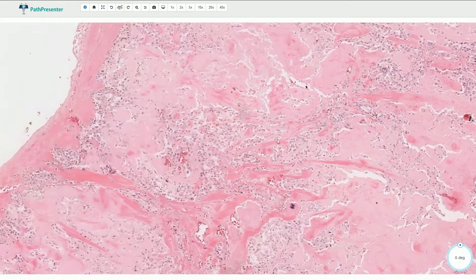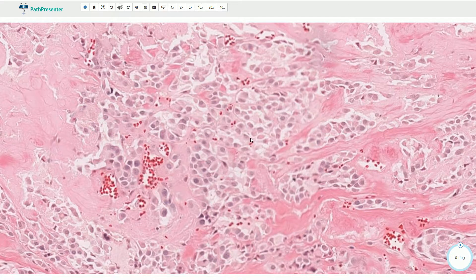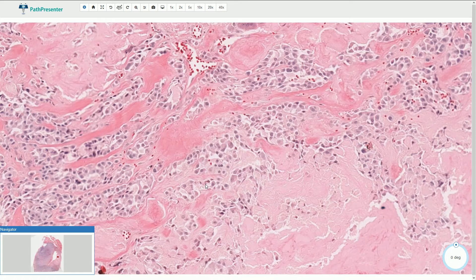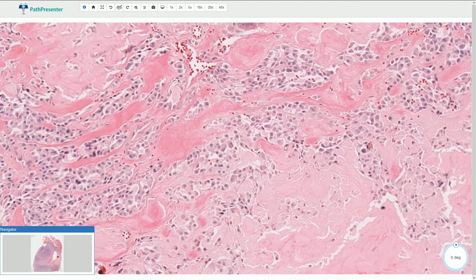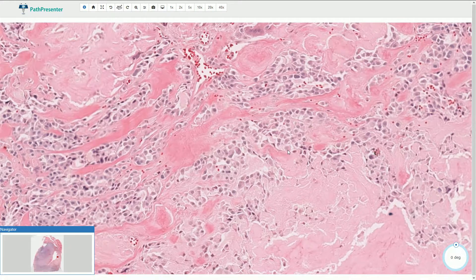Here we see the lesional neoplastic cells that typically have a plasmacytoid appearance — they have relatively uniform round nuclei which are eccentrically located in the relatively voluminous cytoplasm. Medullary carcinoma can be associated with multiple variable patterns. The plasmacytoid appearance of the cells is probably the second most useful clue after amyloid deposition.